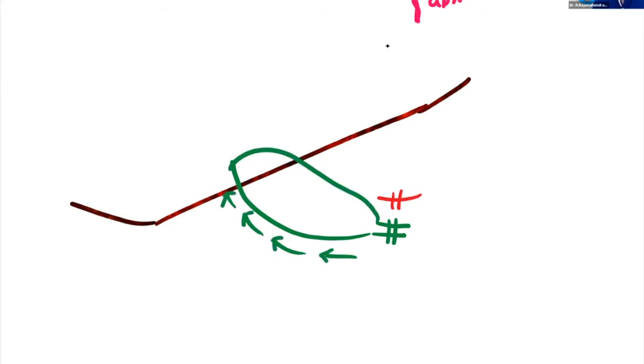I am going towards the gallbladder now. I am dissecting from below upwards. Like this, I am dissecting and going from below upwards. This technique is what we call retrograde cholecystectomy, but Bailey has wrongly given this as antegrade cholecystectomy. Actually, we call it retrograde. From inferior, we are going above. So retrograde cholecystectomy is being done.